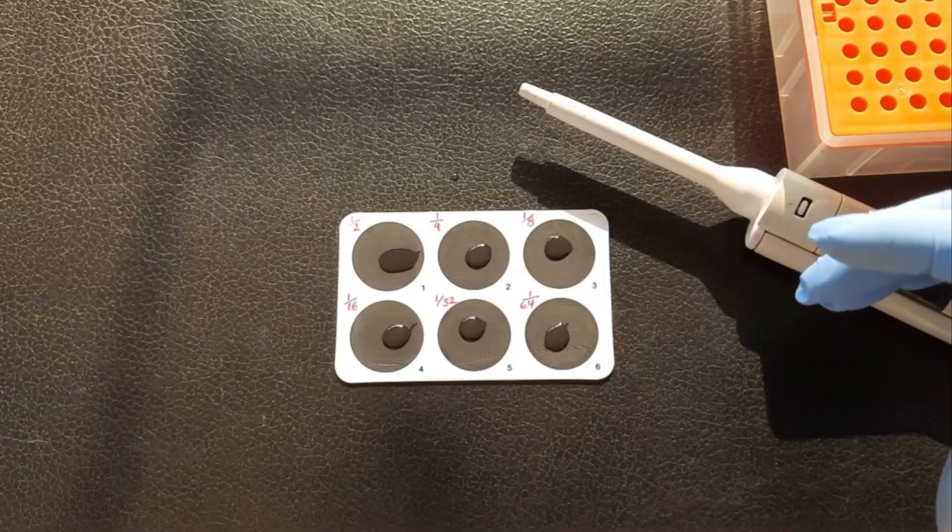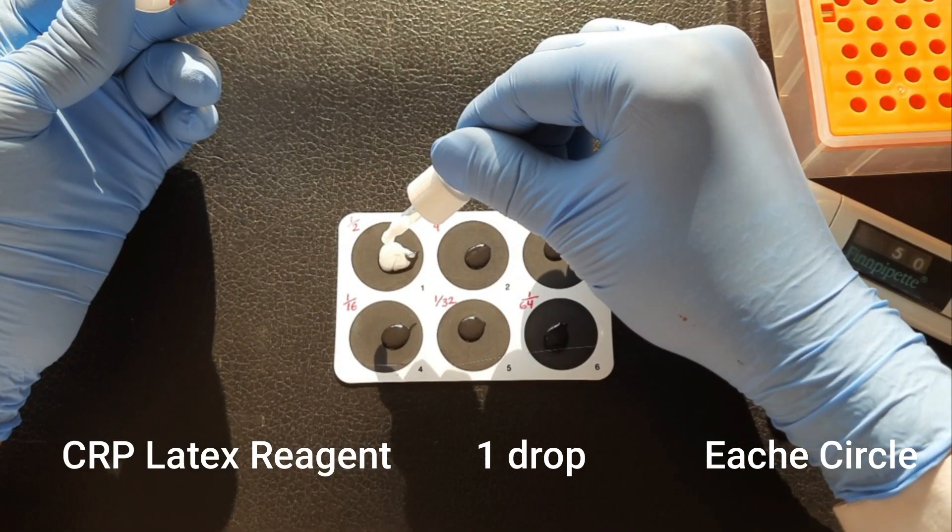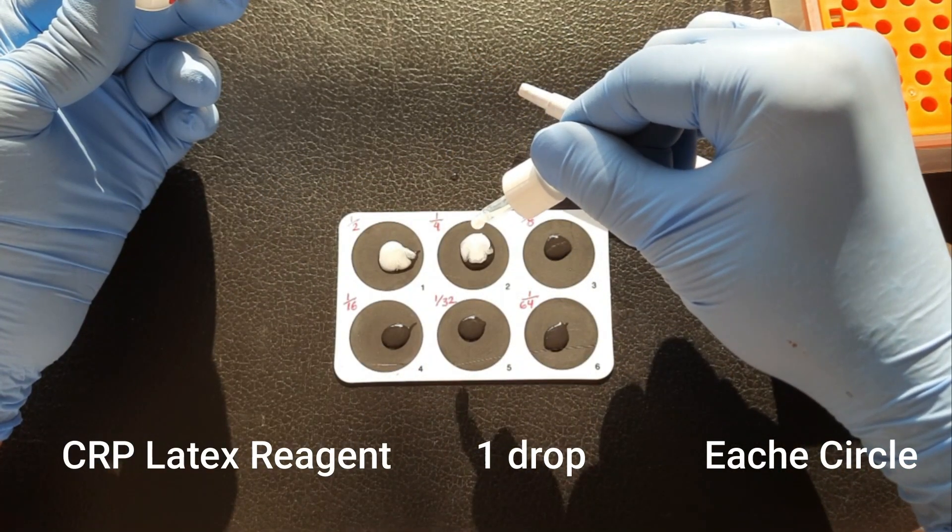Now, add 1 drop of 50 microliter of CRP latex reagent on each of the circle, from circle 1 to circle 6.